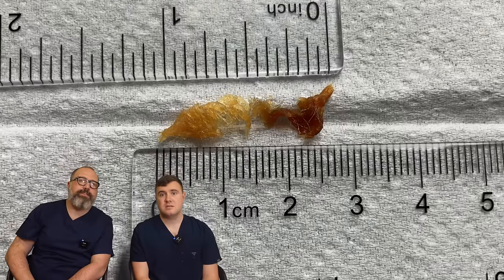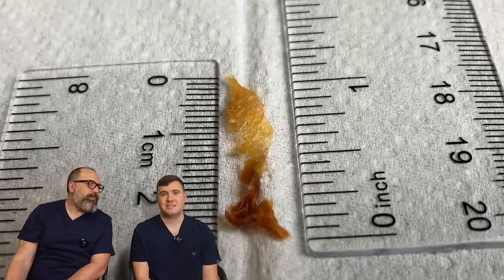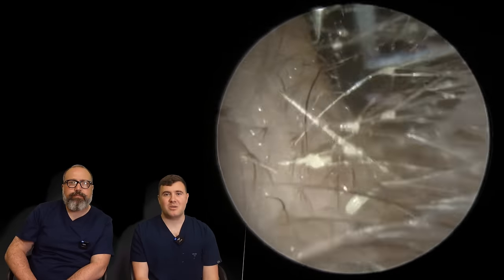Two and a half centimetres of wax and skin — that's about an inch. That's a nice easy one. I think it might be yours next. Yeah, I think you've got quite a beefy one as well today. Quite a good one, quite a long one.